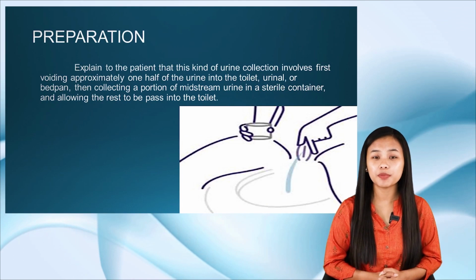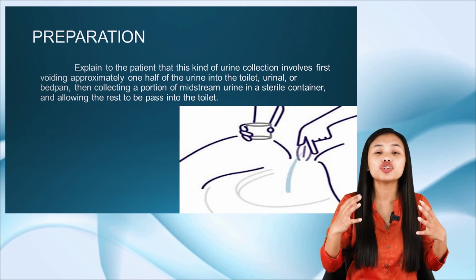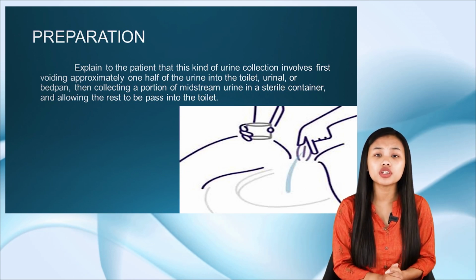So before you advise the patient to perform this midstream or clean catch urine specimen, you should make sure that you prepare them for this procedure. And how can you do this?